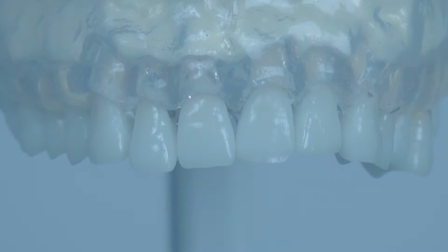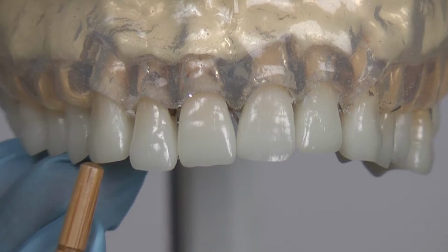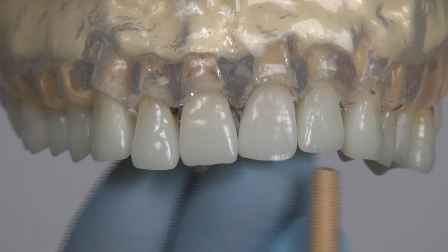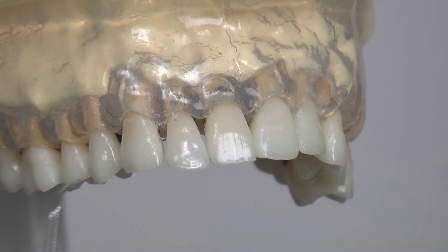The Gracey 1-2 curette is site-specific and can be used on all anterior teeth, from canine to opposite canine on both arches. It is used primarily for root planing and as a follow-up to extensive subgingival calculus deposit removal.